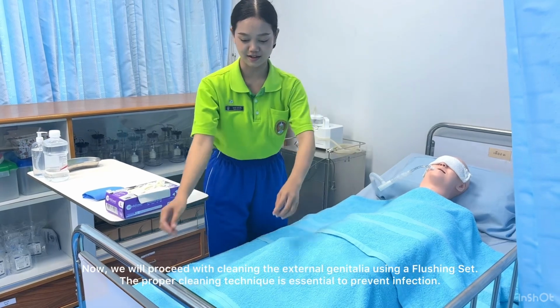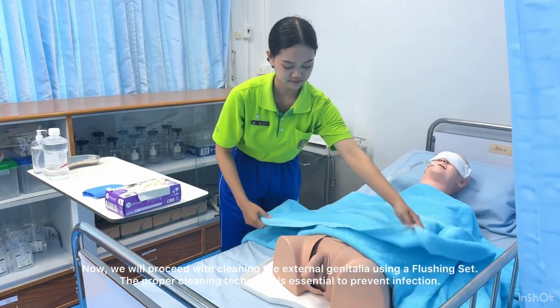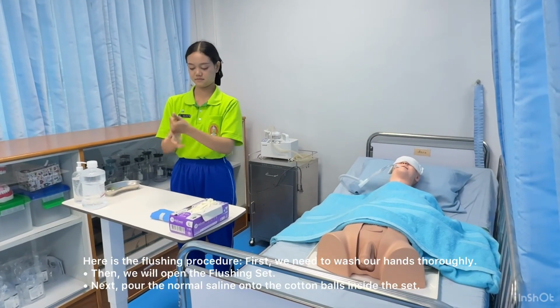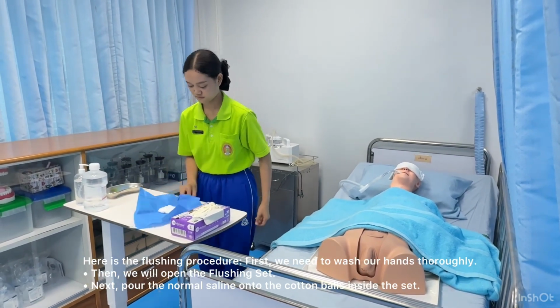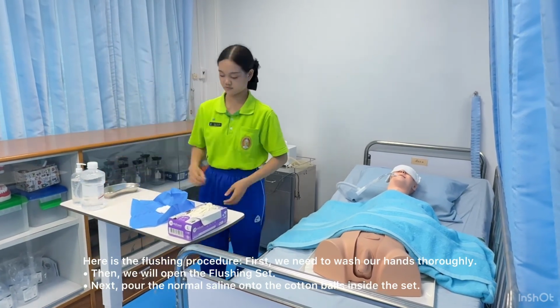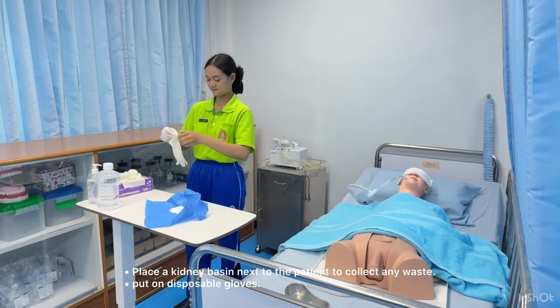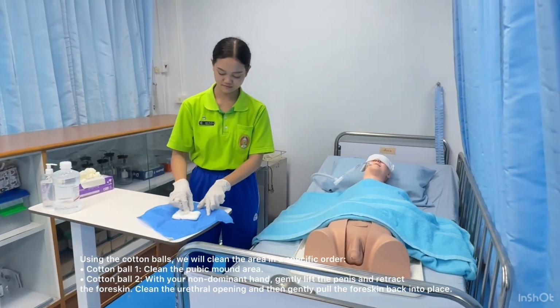Now, we will proceed with cleaning the external genitalia using a flushing set. The proper cleaning technique is essential to prevent infection. Here is the flushing procedure. First, we need to wash our hands thoroughly. Then, we will open the flushing set. Next, pour the normal saline onto the cotton balls inside the set. Place a kidney basin next to the patient to collect any waste. Put on disposable gloves. Using the cotton balls, we will clean the area in a specific order.